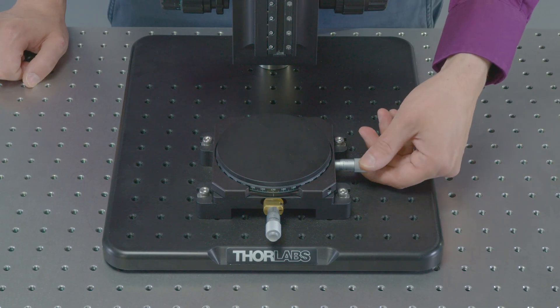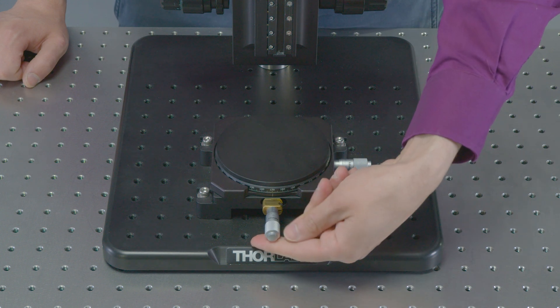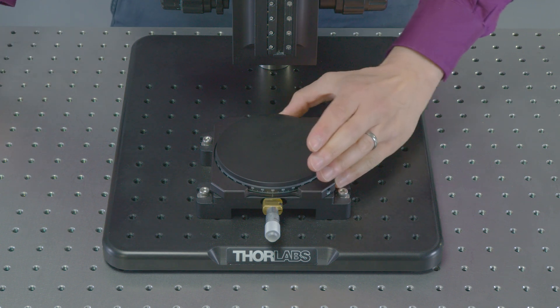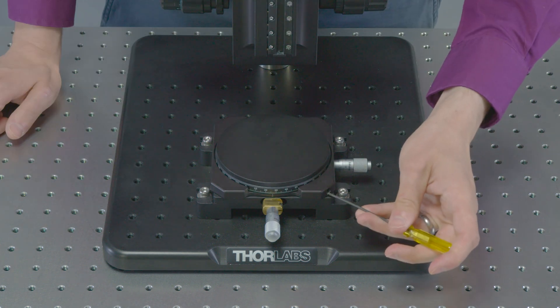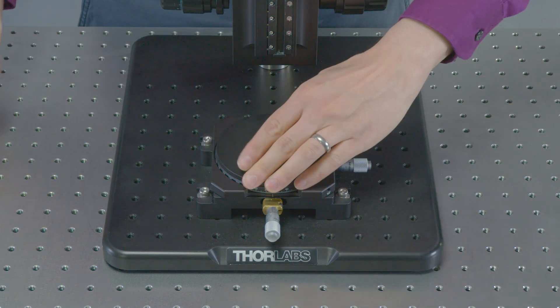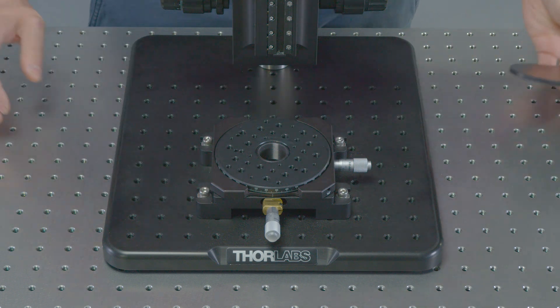The translation stage allows for translation in the x and y axes plus rotation. When rotating the top plate, you can use the angular orientation scale and fix the position by tightening the locking screw. Remove the solid top plate to find additional tapped holes for flexible sample alignment.